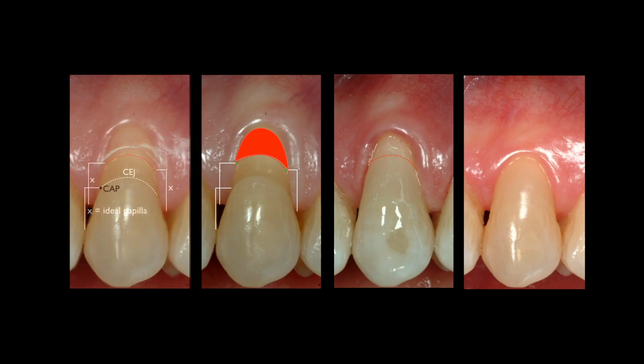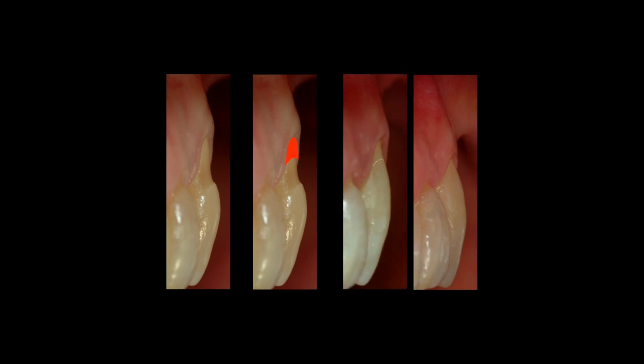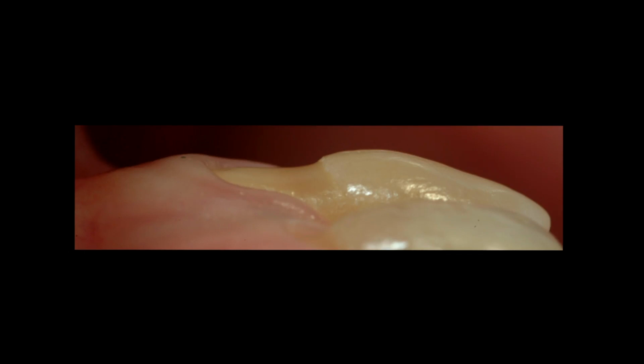And also, in terms of the maintenance phase, you change a situation in which the cement enamel junction was shifted so far coronally with respect to the tip of the papilla, so that now a new emergence profile was created with a good amount of keratinized tissue and good soft tissue thickness compared to the composite restoration. And this was done by making first the composite restoration and after the coronally advanced flap.